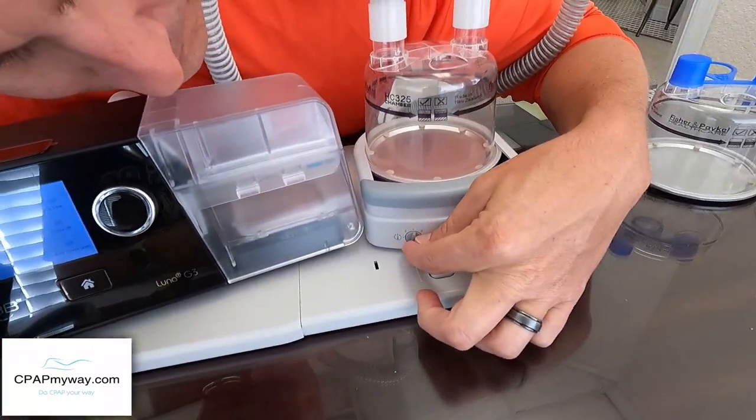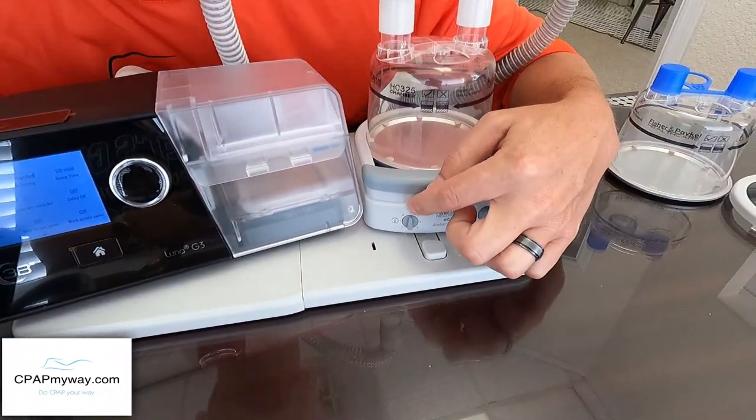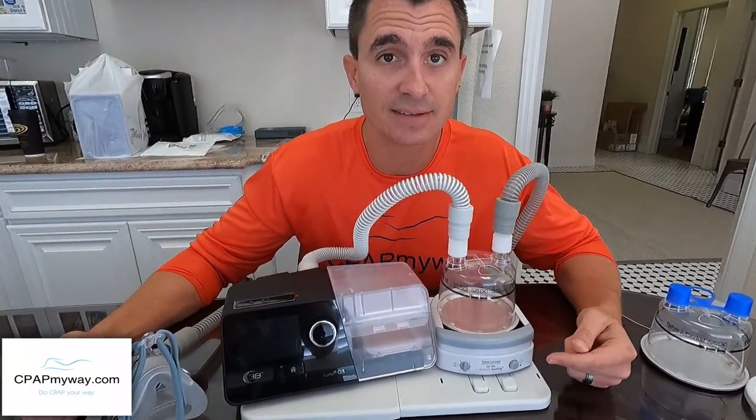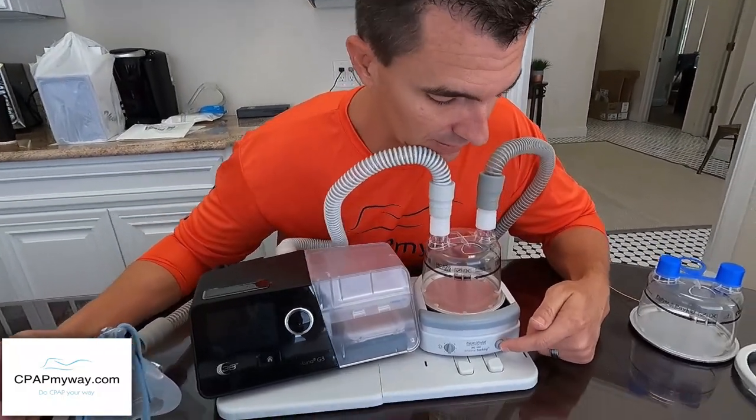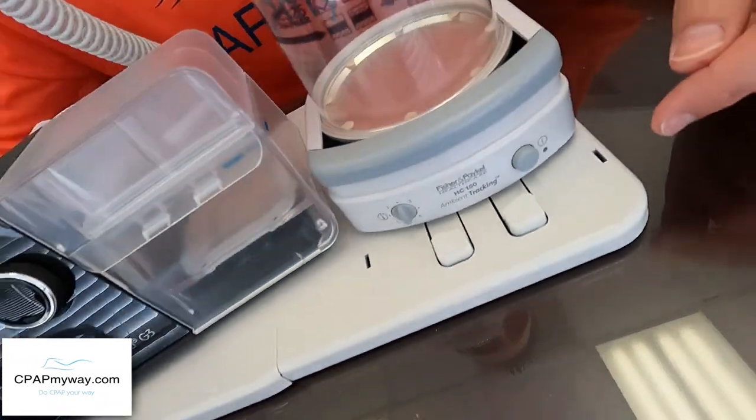Then on the HC-150, set it to the 2.5 setting. It can go as low as 1 or as high as 4 — start at 2.5. We want to deal with one humidifier at a time. If it doesn't resolve your issue, gradually increase from there. On the front of the HC-150 there's a power button — press it and you'll see a little green light indicating the heated humidifier is on. In the dark you'll definitely be able to see it.